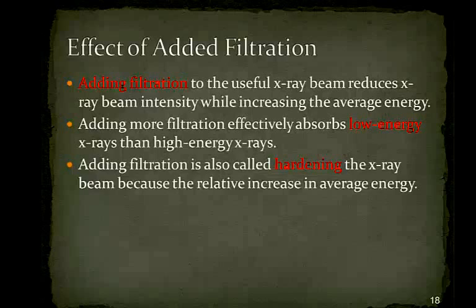What we're trying to do is get rid of low energy X-rays, because low energy X-rays are responsible for what is called skin dose. They're useless. All they are going to do is be bad for the patient and give no good detail, and that's why we call them skin dose. So filtration in a sense just puts a little filter that is not going to completely stop the beam. It's just going to get rid of the low energy X-rays.